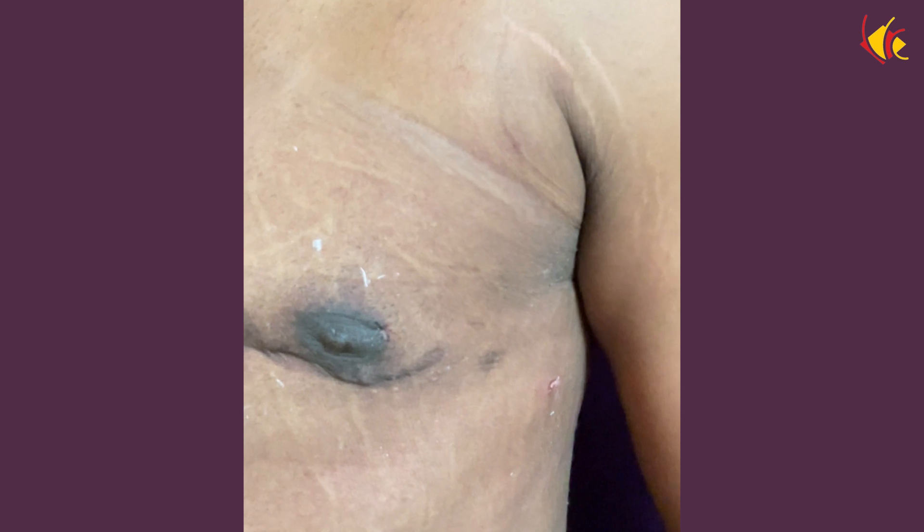In the next stage, we will be doing the scar revision, making the scar smaller and reducing the deformity.